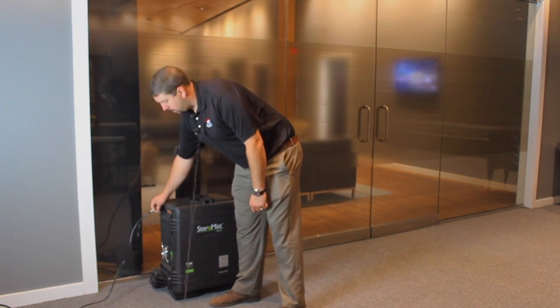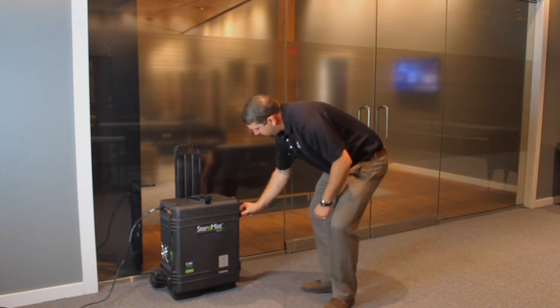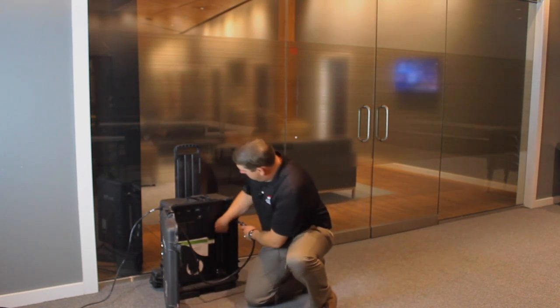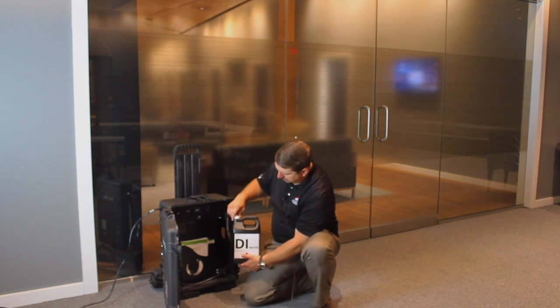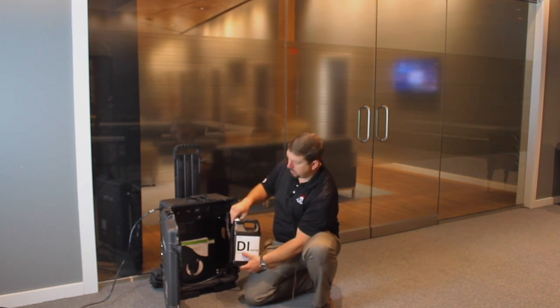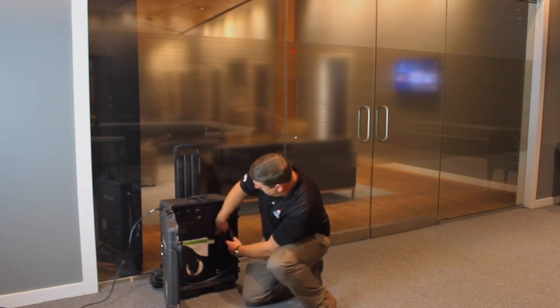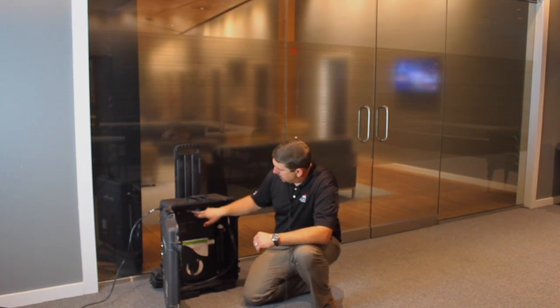We've got a little bit of a head start — the unit is plugged in. We're going to go ahead and turn it on and open it up. The solution we're using today is just deionized water. Normally we would have a 7.8% hydrogen peroxide solution, which requires minimal PPE such as goggles, gloves, and an N95 respirator mask.